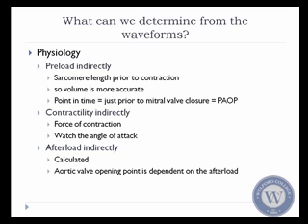But one of the bigger mistakes that are made is that people are taught just to look at the mean of the waveform, which is not really true. It's not the mean that you should be looking at. You should be looking at the point where the C wave is being generated, and that's really the optimal point in time, which indicates to you either right or left ventricular end diastolic volume or end diastolic pressures.